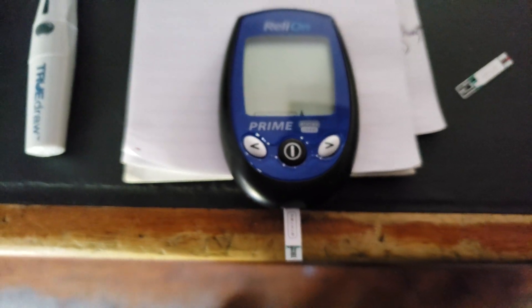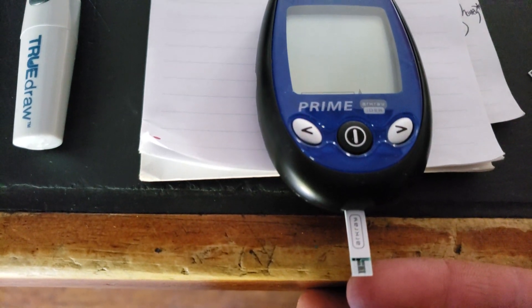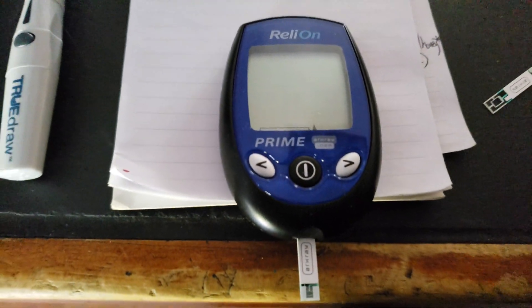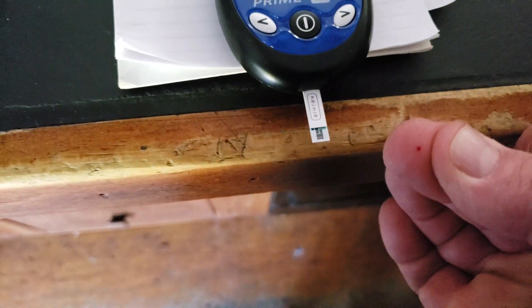So I'm going to do a test now. It's ready to roll. All you have to do is prick your finger, clean off the first drop of blood, second drop of blood. It sucks it right in there and tests it for you.